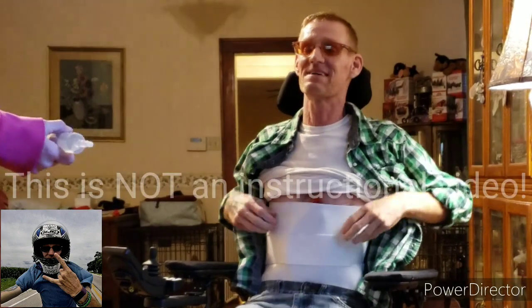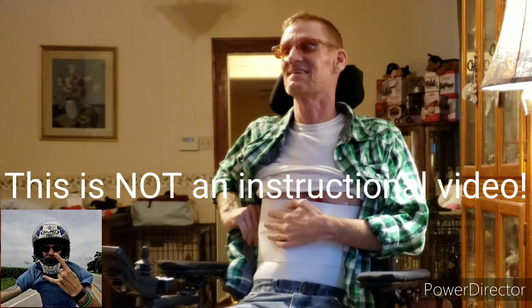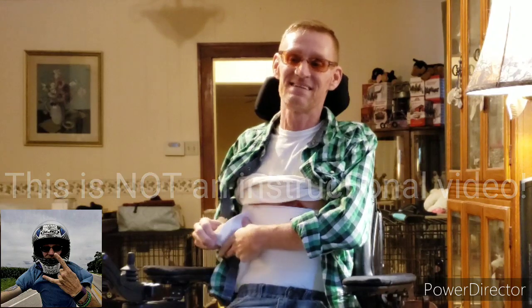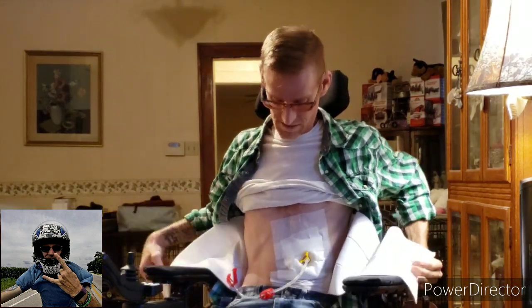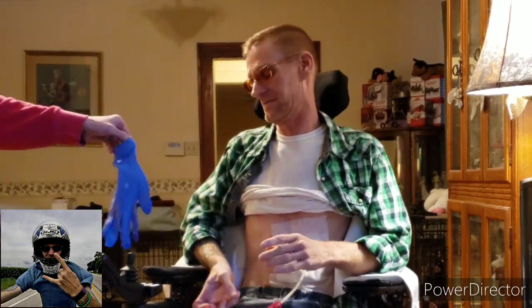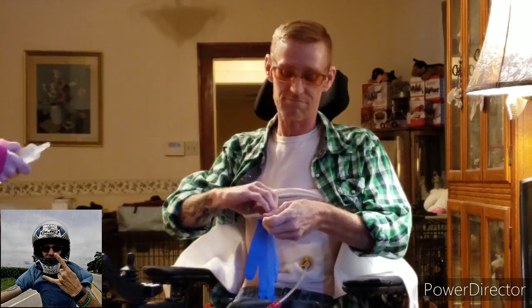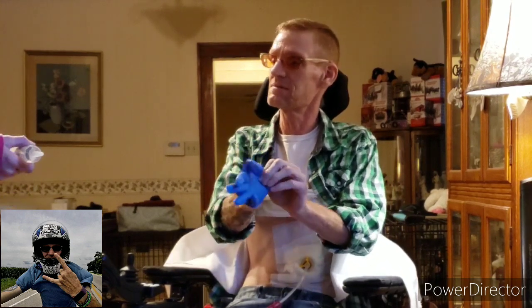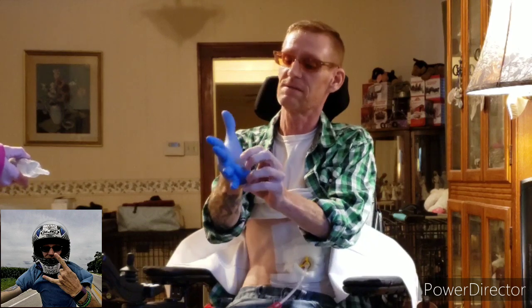It's all in here — we'll have fun, I'll edit it anyway. Not an instructional video. Okay — clean, clean things, clean wipes. Wipe the tip of it off.